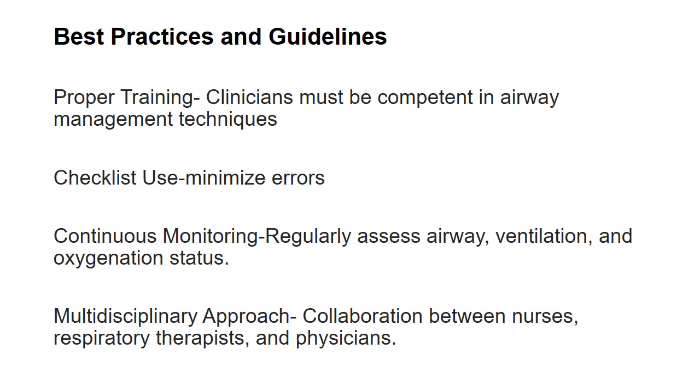Lastly, what are the best practices and guidelines? Proper training. Clinicians must be competent in airway management techniques. The clinicians who are handling these patients must be competent in maintaining airways. And always follow a checklist, because it minimizes errors to a great extent. Continuous monitoring is very important. Regularly assess the airway, ventilation and oxygen status of the patients.